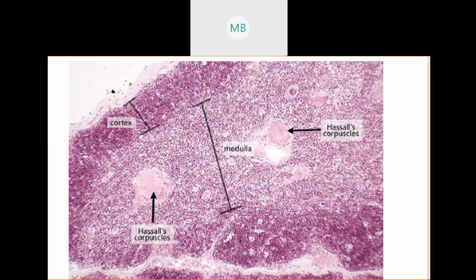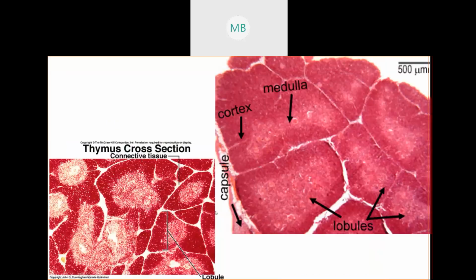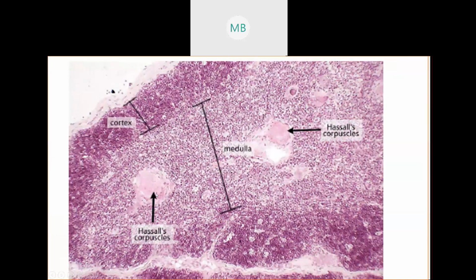But you have these little clusters that look like hurricanes throughout these pictures. Again, you can see some of these right here on this one, like these little hurricane dots in the middle of the medulla. You see more of them in that first picture I showed you. You have two potential names for those little hurricane-looking dots, because you have two names for them on your lab list.